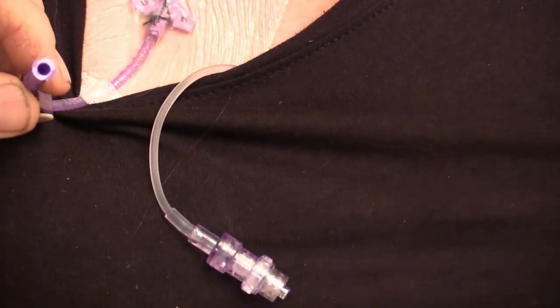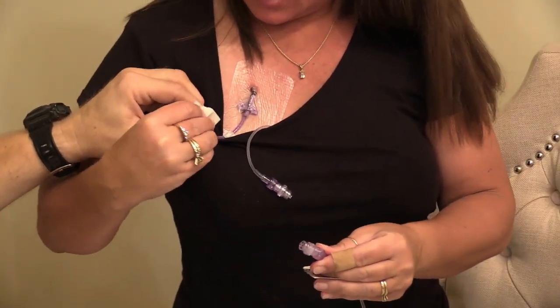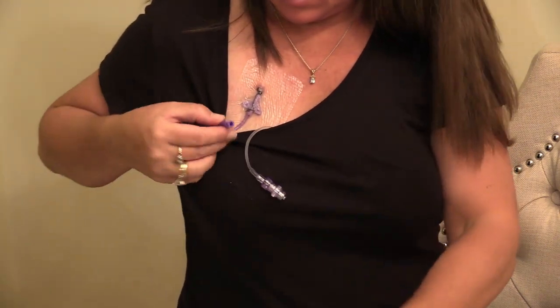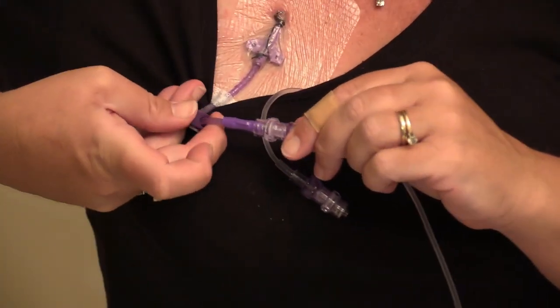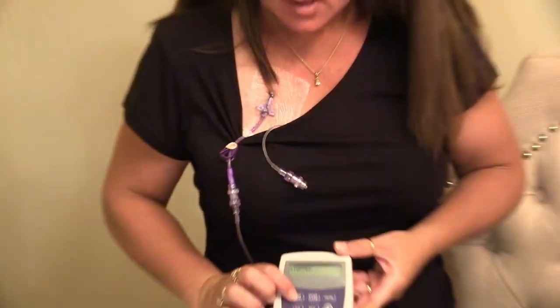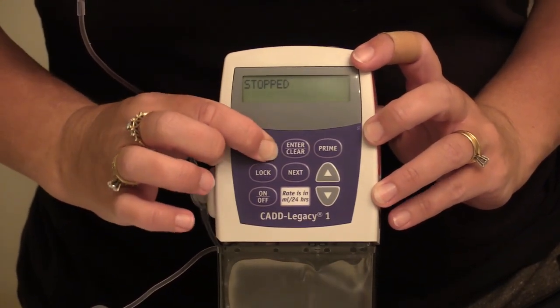We're going to clean this again in case we touched it, and then clean this side too. This is not a two-person job but it's easier with two people. Then tighten that, unclamp, and on the pump press start and hold it in.